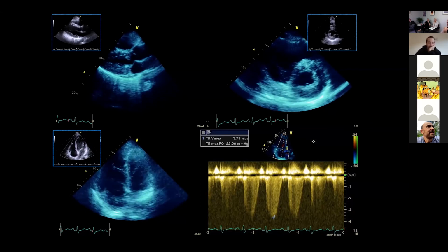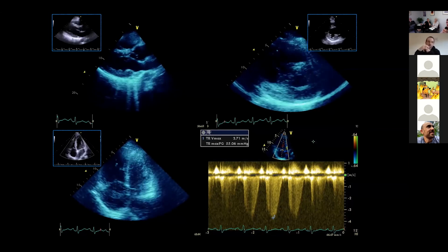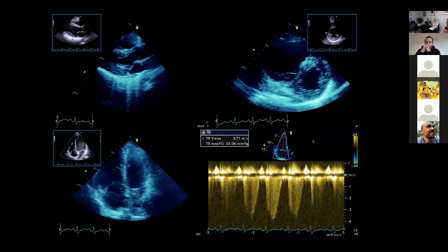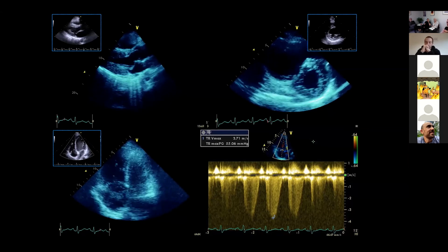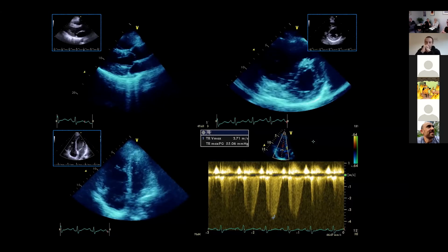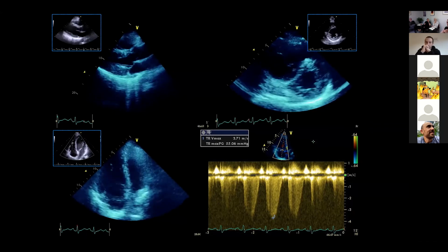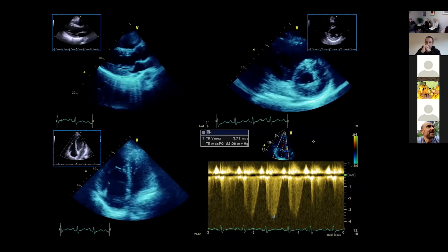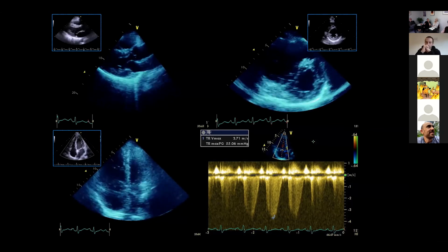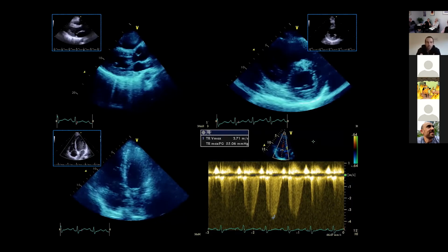Exactly. People use the blood pressure, but it's misleading because that's a massive PE. I don't care what the blood pressure is. You don't have changes like that in a 35-year-old woman unless you've got a massive PE. The reality with this woman is that if she deteriorates, she's going to die on you. And as you can see already, her RV minus RA pressure alone is 55, and that's before we have the CVP. She's got severe pulmonary hypertension, and it has to be a PE.